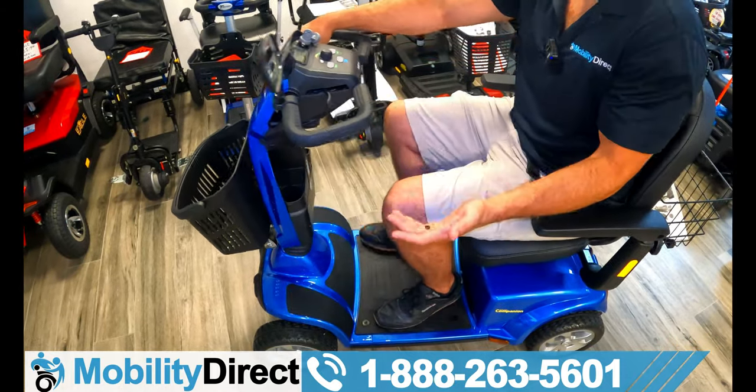Now I'm going to show you how to take this unit apart for transport. First, we have the universal basket in the back — there's a little knob you loosen and it pulls right out. It comes with a complimentary high-visibility safety flag. There's a little pocket in the back of the backrest for that, and you can also store things like your user manual and charger in there.